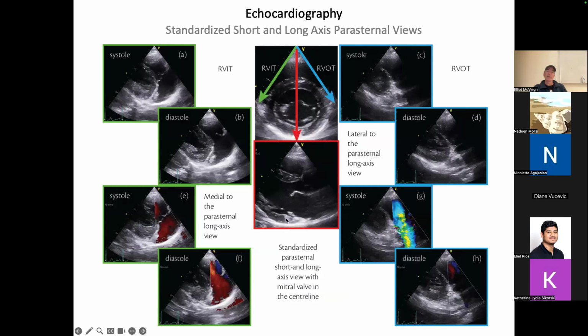Okay, so this is the lateral wall down here. And left atrium. And then if I tilt towards the right ventricular outflow tract, I can see that, right, during systole, I can see the flow out of the right ventricle towards the pulmonary artery. And then if I tilt towards the right side here, what am I seeing here?